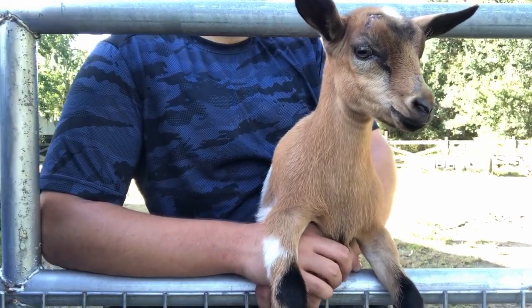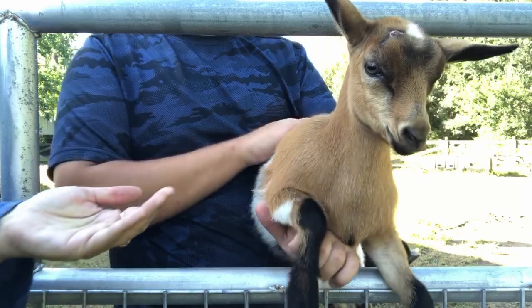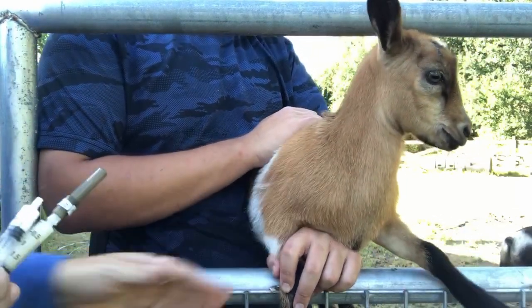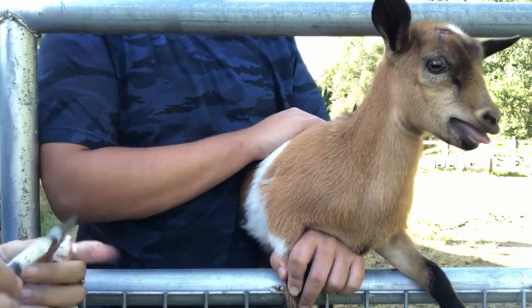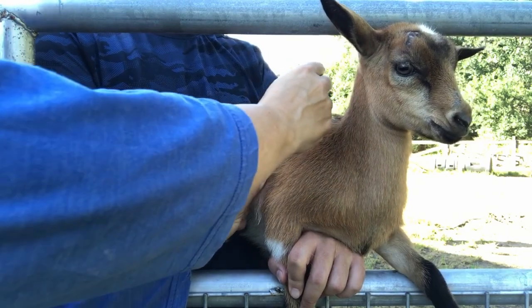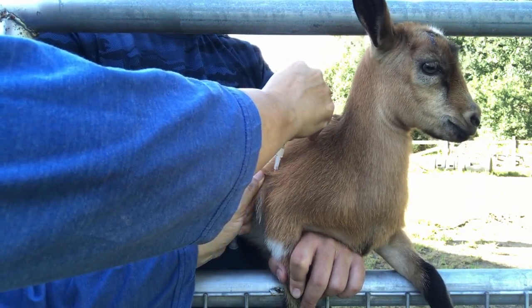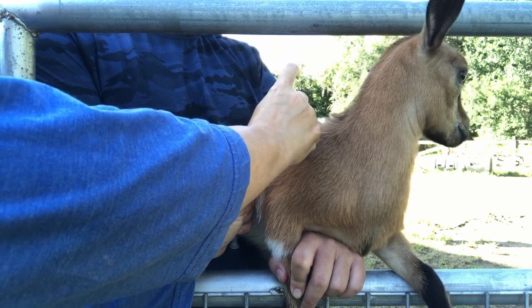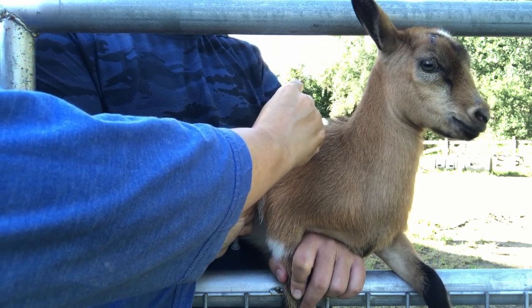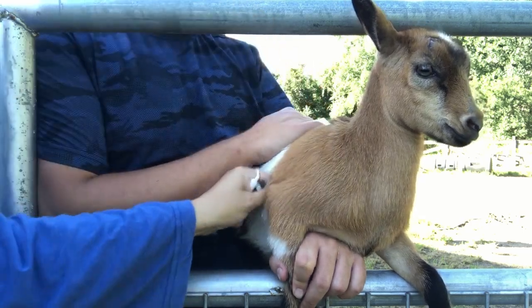Okay, here's our little chamoisée tricolor — she's so pretty, little doe. I'm going to put the alcohol gel here behind her elbow. I'll pull out the tent, inject the needle, pull back slightly to make sure it's not in a blood vessel, and then slowly inject the two cc's of CDT, pull out and rub.